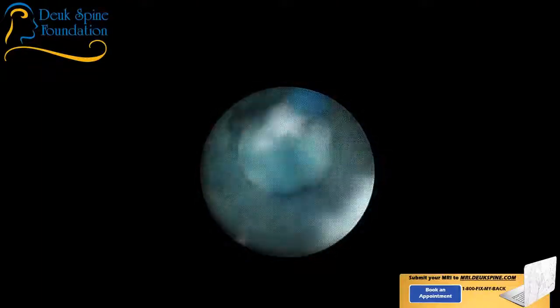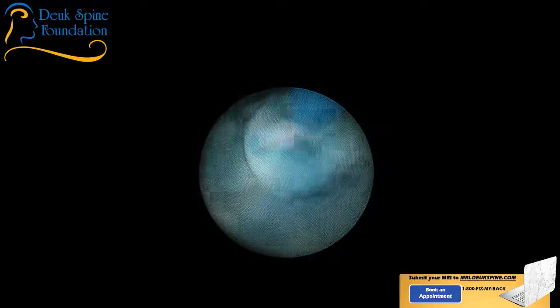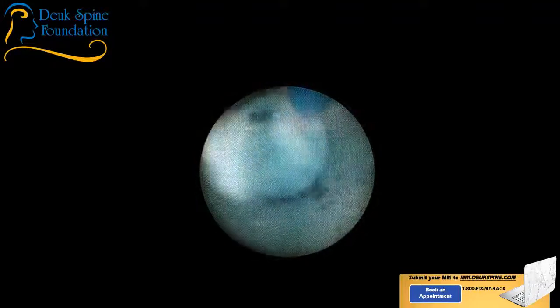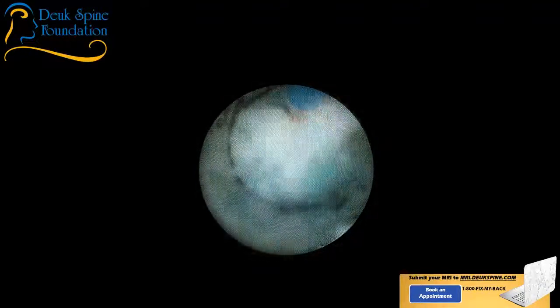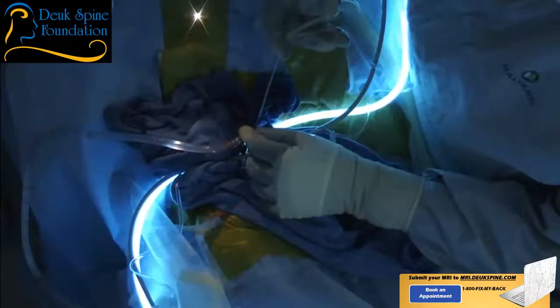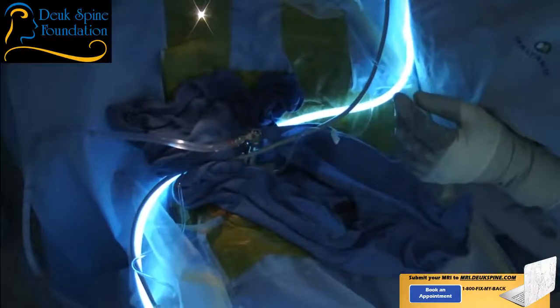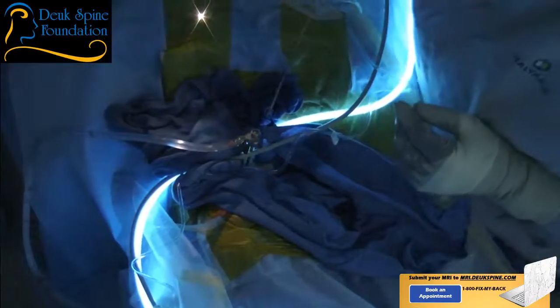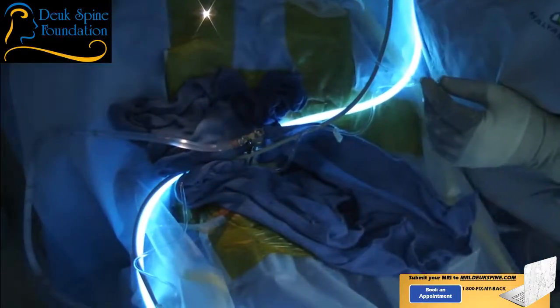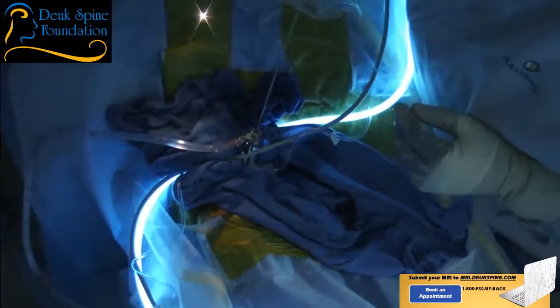The bigger one was at C6-7. We've already fixed that one. The smaller one is at 5-6. They wanted both herniations fixed at the same time. They didn't want to have two surgeries, so we're doing them both. The herniations were irritating the nerves going down the left side. So neck pain, arm pain, and a little bit of numbness. I don't know if she had weakness. I can't remember. You guys know?